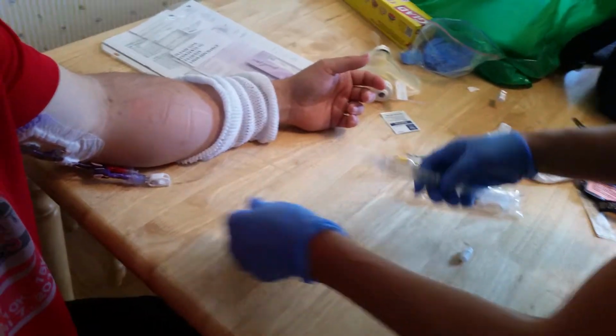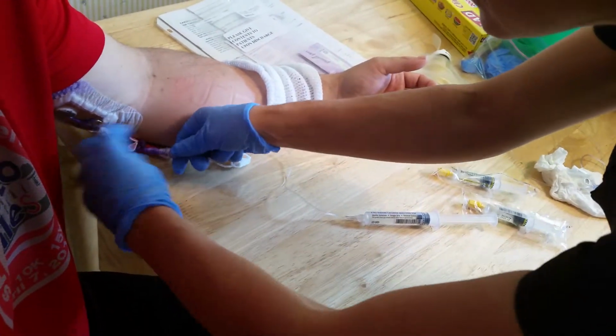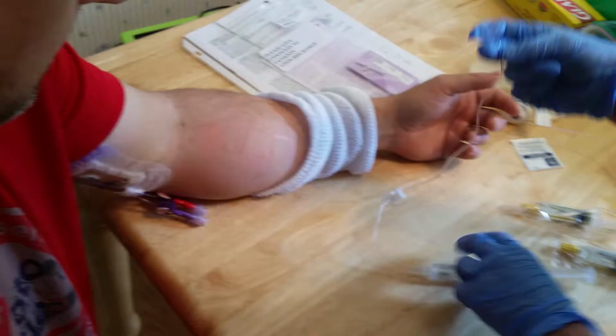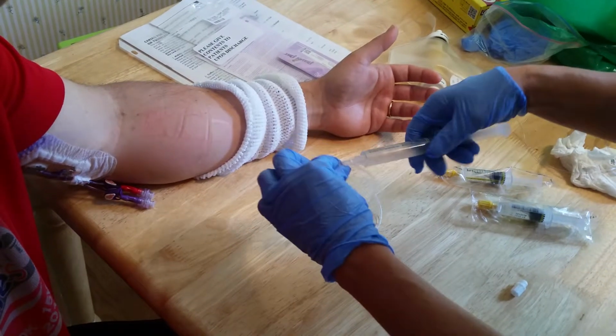So then we actually don't even need to flush from this part because it'll use up some of the saline. So what I'm going to do is disconnect it from here. You just twist and that just comes off. So that's the extension tubing that we used. But if I'm by myself, then I'll just keep it on and flush it right from here.